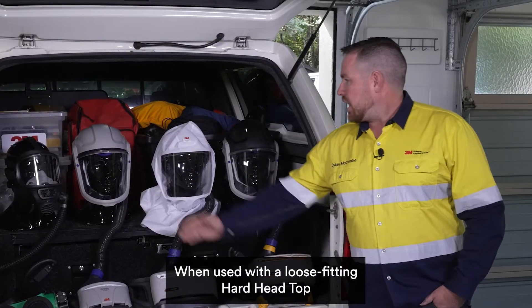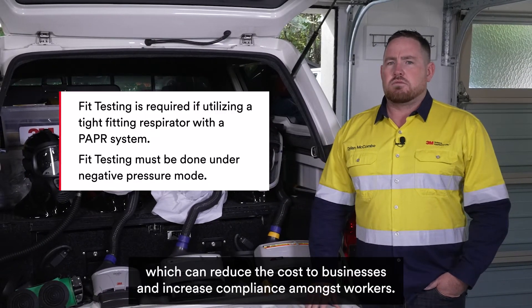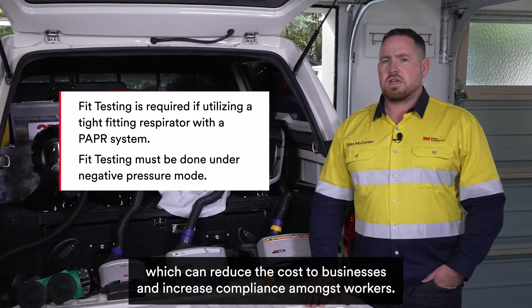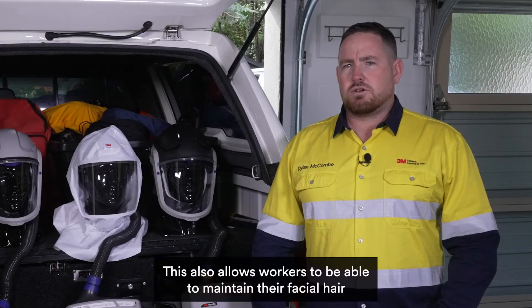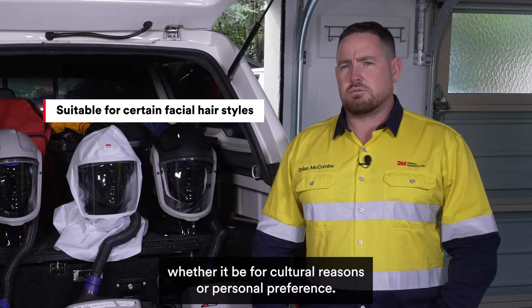When used with a loose-fitting hard head top or soft hood, workers do not require fit testing, which can reduce the cost to businesses and increase compliance amongst workers. This also allows workers to be able to maintain their facial hair, whether it be for cultural reasons or personal preference.